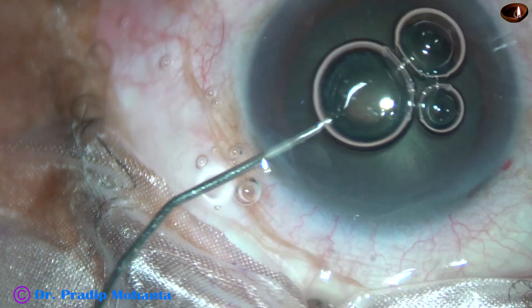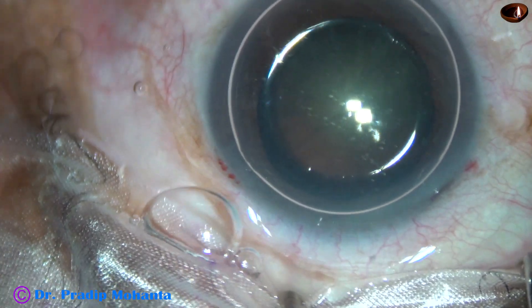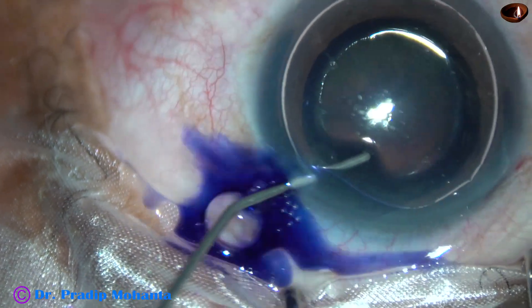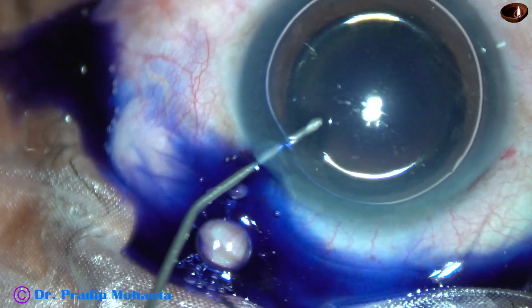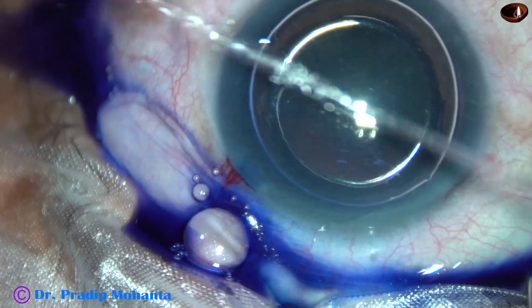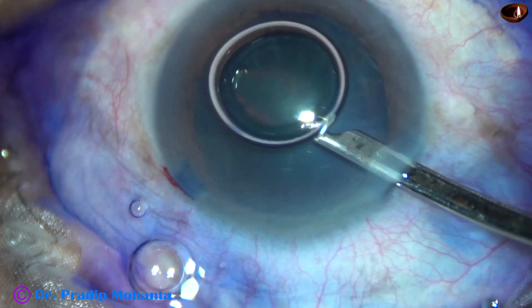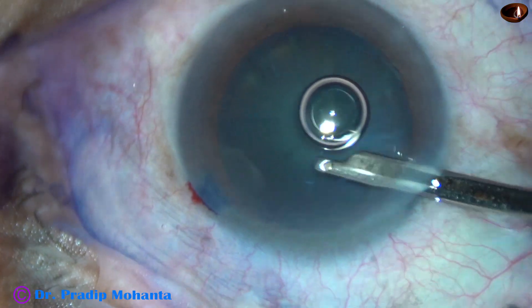In this case, I am going to stain the anterior capsule of this cataractous lens with trypan blue dye underneath this air bubble. The dye is applied in such a way that it stains all parts of the anterior capsule. Then the dye is washed out using BSS and a 23-gauge Simcoe cannula.